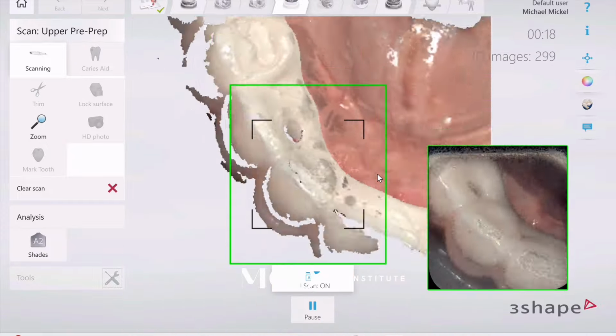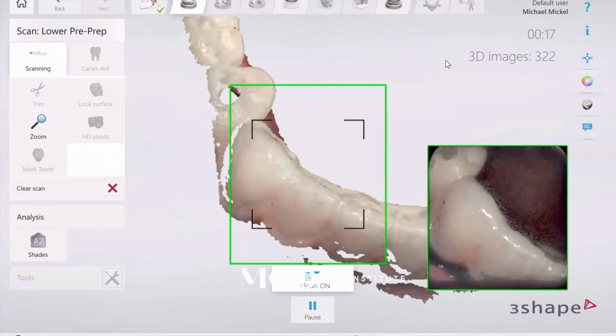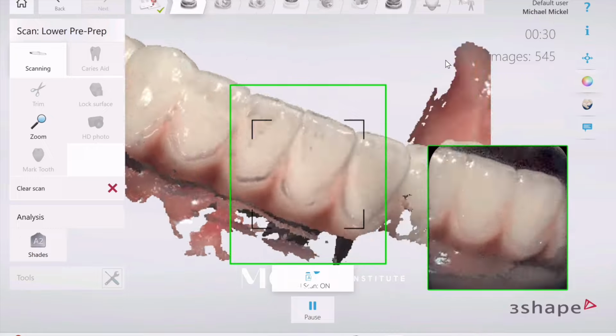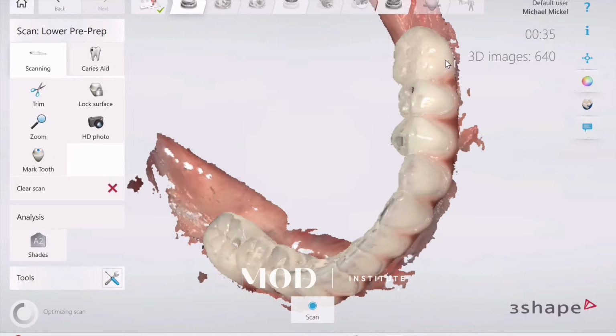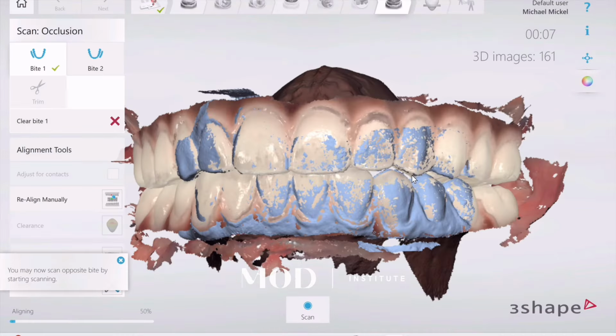So the first step I would do is, if there is a prosthesis in place, go ahead and scan that. In this case, I'm using the Trios 5. I'm scanning the maxillary arch and the mandibular arch prototype prosthetic. These could be pickup prosthetics or anything else. And I'm going to capture the vertical and the bite.